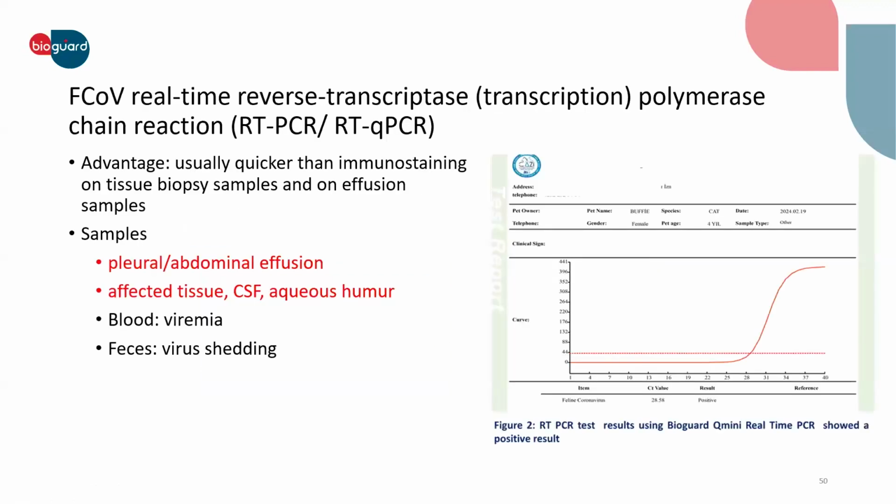Another commonly used test is the reverse transcription PCR, or RT-qPCR. The advantage of the reverse transcription real-time PCR is that it is very quick and also highly sensitive.